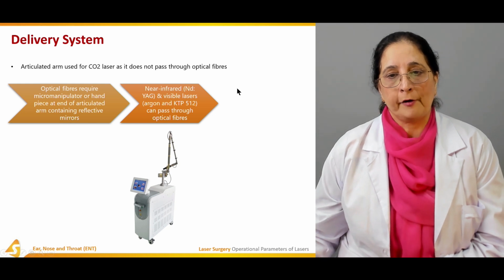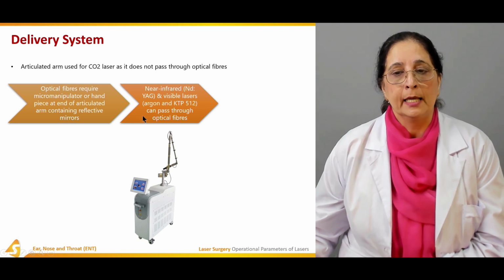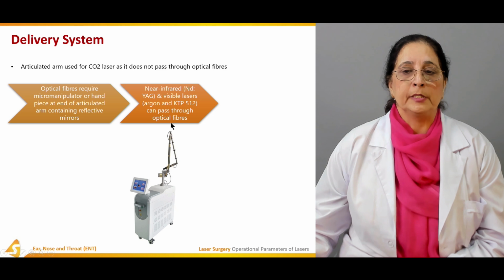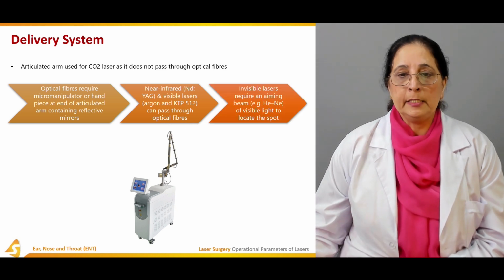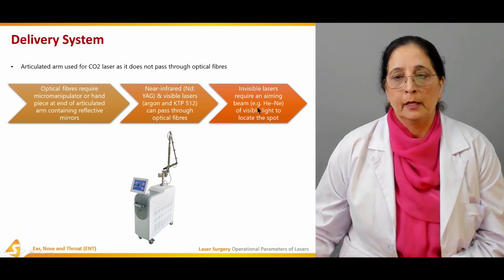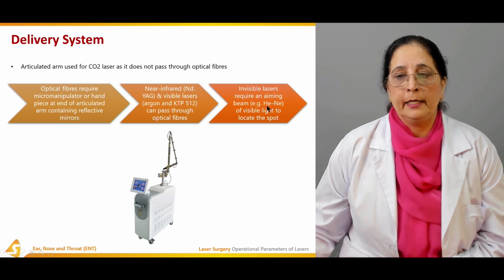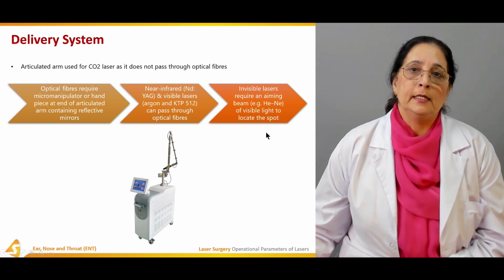Near infrared Nd:YAG and visible lasers, Argon and KTP, can pass through optical fibers. Invisible lasers require an aiming beam, for example helium neon, of visible light to locate the spot.